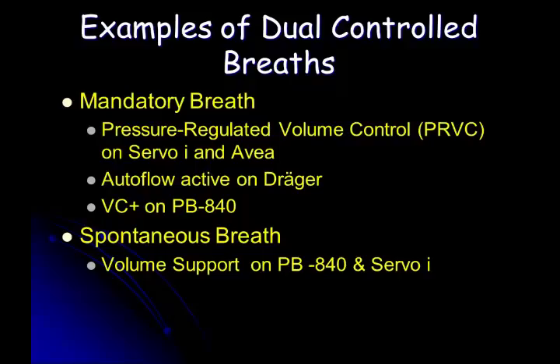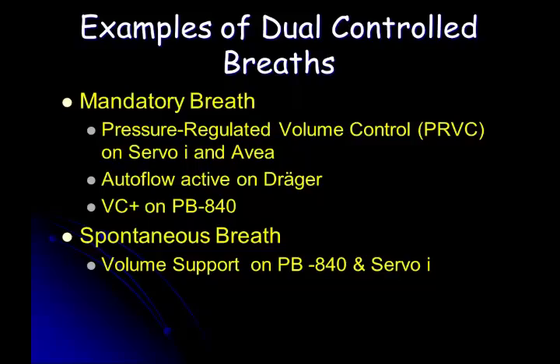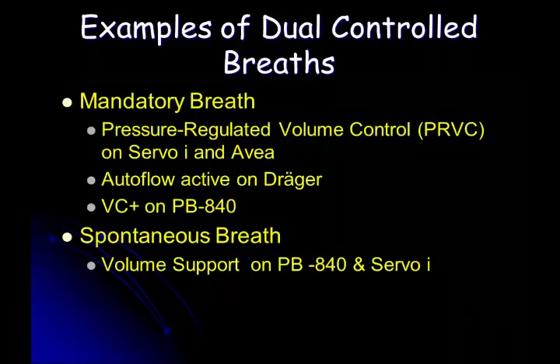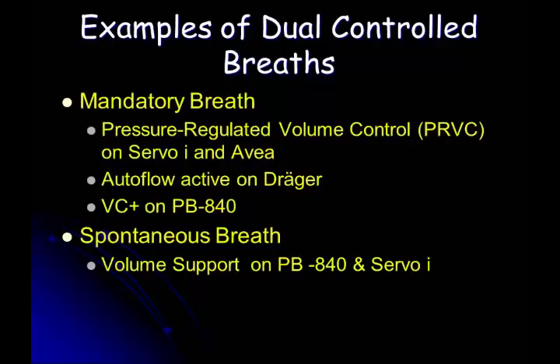There's a whole bigger problem with dual that I'll talk about later once you get a little bit of a better understanding of it. If someone told you it's the best thing since sliced bread, you would say, what's the downside? And there's a huge downside if people don't know what they're doing. Downside to dual control. It's making an assumption that is a very, very dangerous assumption.